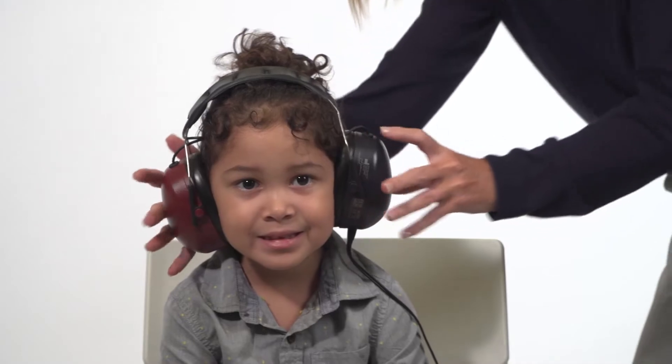Place the headphones directly over the subject's ears with the red phone on the right ear and the blue on the left. Remove any obstruction that may interfere or be uncomfortable, such as glasses.